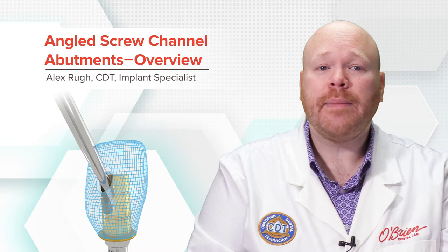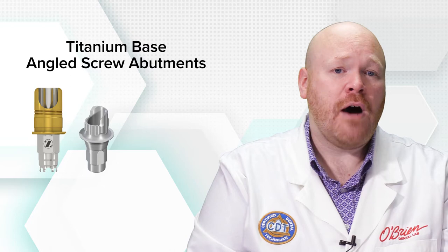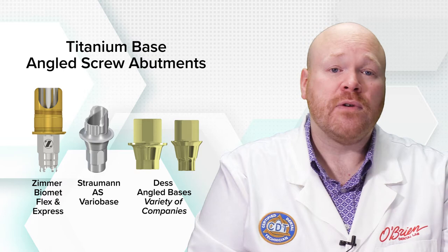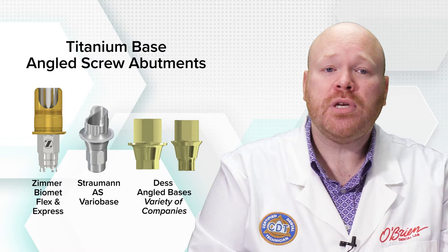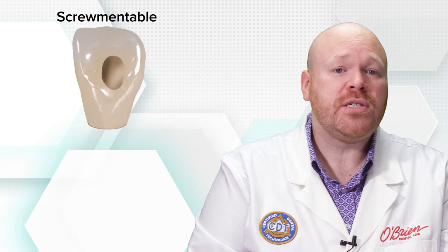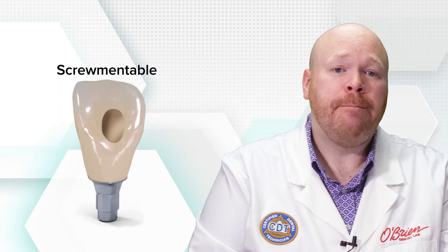There are a few different styles of angled screw channel abutments, but by far the most common is the titanium base. Many implant manufacturers offer these bases, such as Straumann's AS VarioBase and Zimmer Biomet's Flex and Express abutments. There are also third-party manufacturers such as DES that make angled bases for a variety of companies, so even if the implant system you work with doesn't offer an angled solution, there may be an option available. Regardless of the manufacturer, the titanium bases are all very similar in design and use. They're all used for screwmentable style restorations where the crown is fabricated with an access hole and then cemented to the base in the lab.